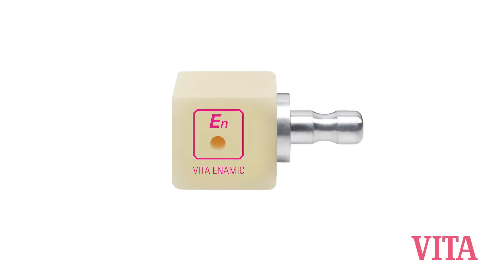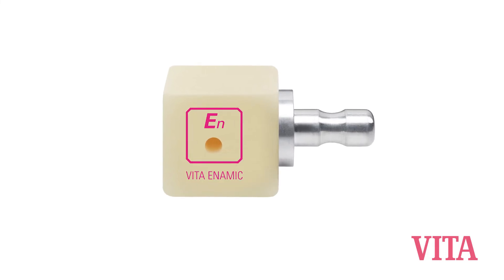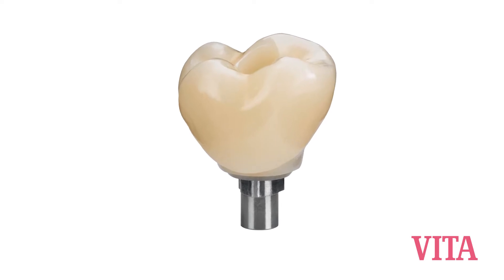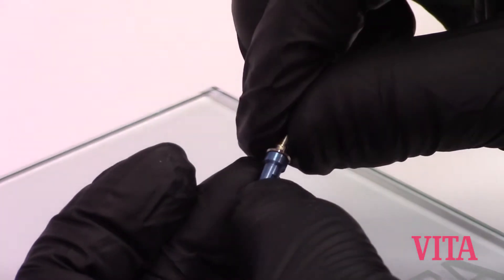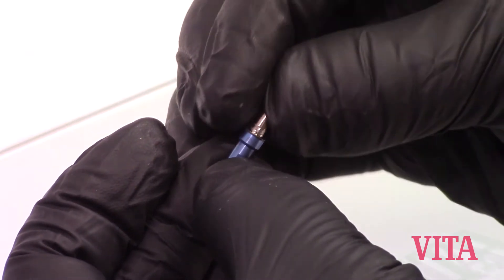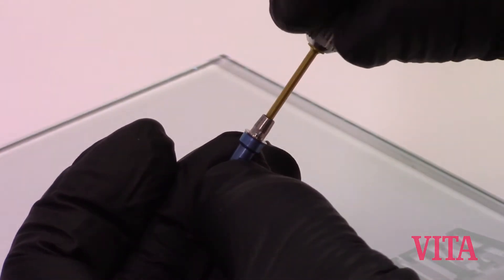Today we're going to go over how we take an Enamic Implant Solutions block and bond it to the tie base. First step, take your tie base and connect it to your implant replica using the appropriate retaining screw that came with your tie base assembly.